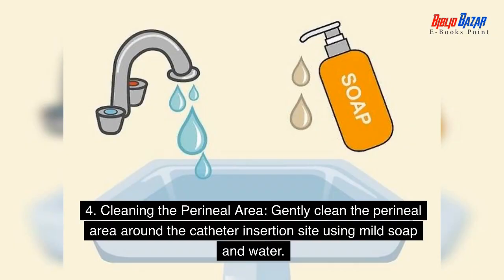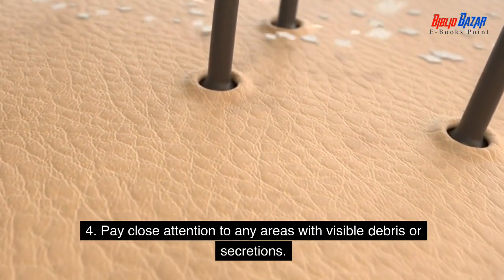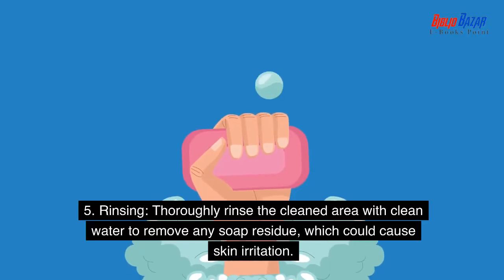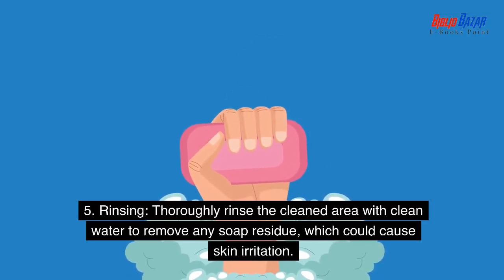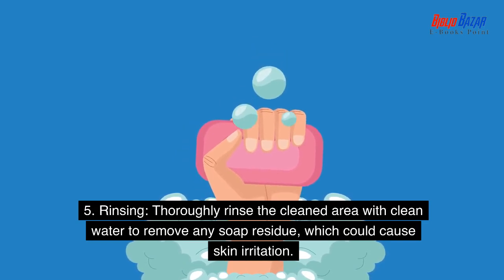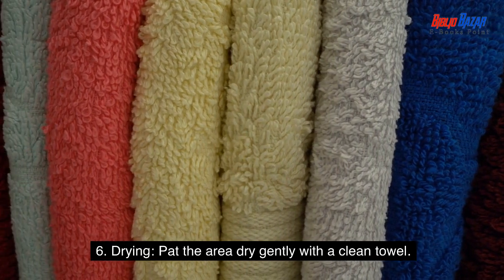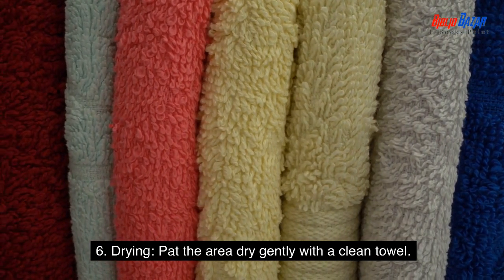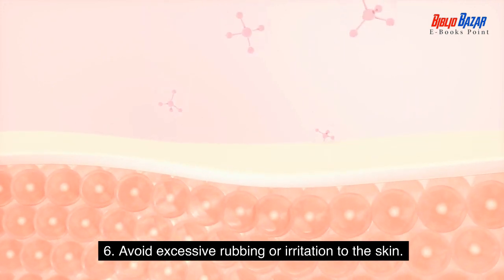4. Cleaning the perineal area. Gently clean the perineal area around the catheter insertion site using mild soap and water. Pay close attention to any areas with visible debris or secretions. 5. Rinsing. Thoroughly rinse the cleaned area with clean water to remove any soap residue, which could cause skin irritation. 6. Drying. Pat the area dry gently with a clean towel. Avoid excessive rubbing or irritation to the skin.